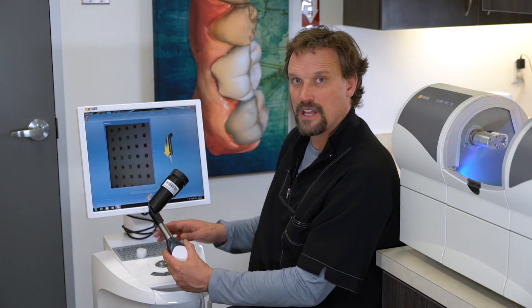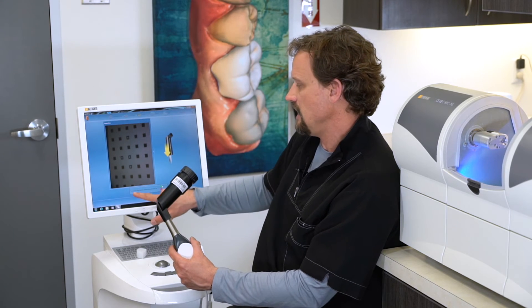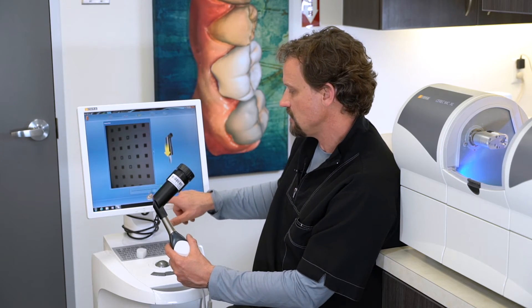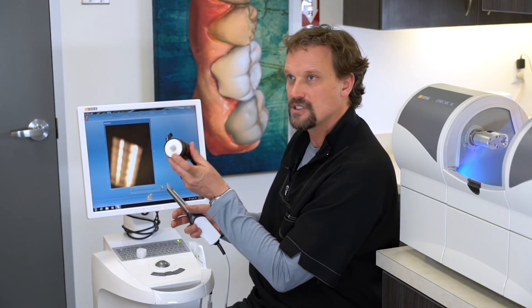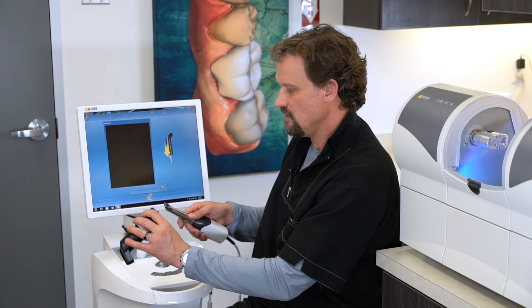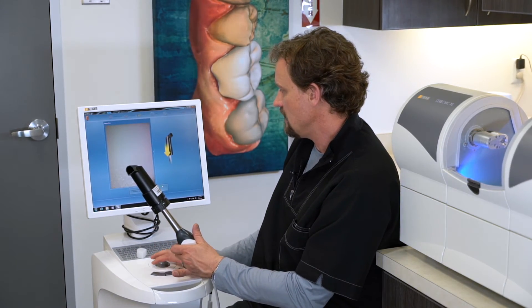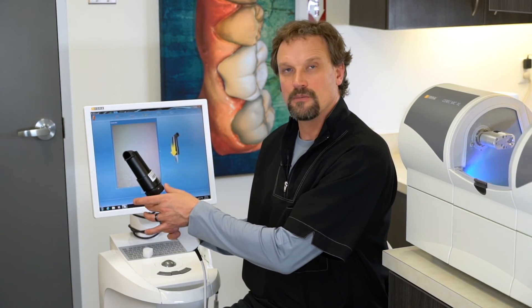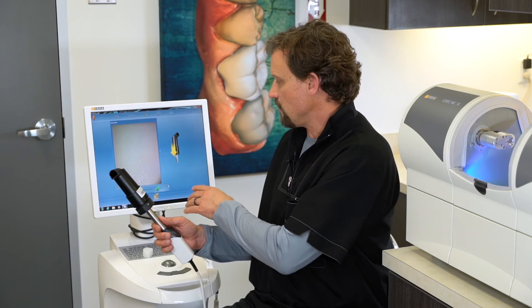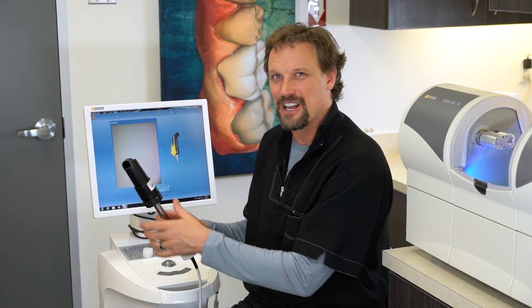You'll get to the point where it tells you to do something different and the graphic actually changes. It says insert the camera in the bottom of the calibration set. So we're going to take this out, and then there's another sleeve for this to go into. It can only go in one way — we'll put that in all the way and hit OK. It'll take a few minutes while it's in the bottom of the sleeve, but eventually you'll get to the point where it says calibration successful. We've got a green check — we've got it calibrated.